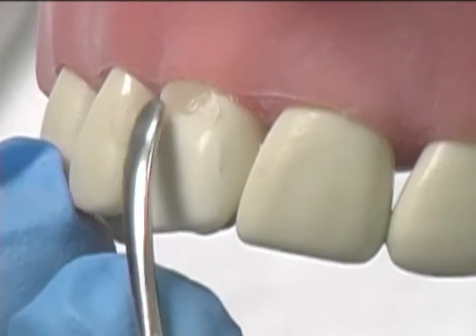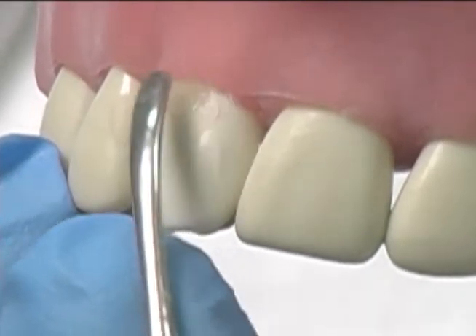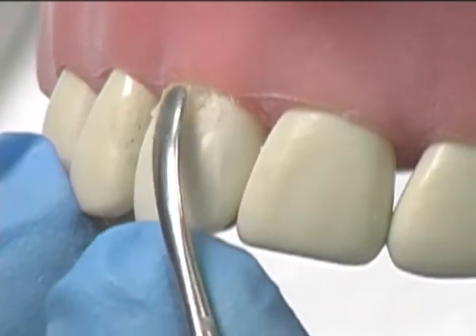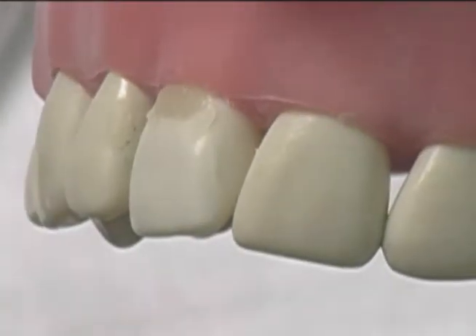Again, take your time, develop the anatomy exactly as you wish so that we can minimize the need for finishing. And now cure the third layer.